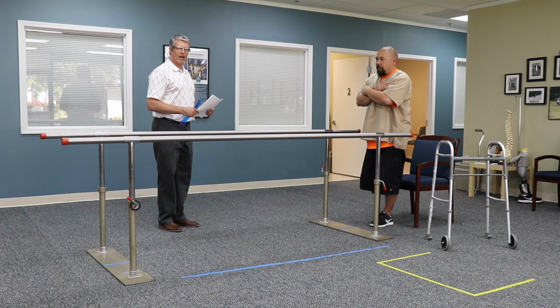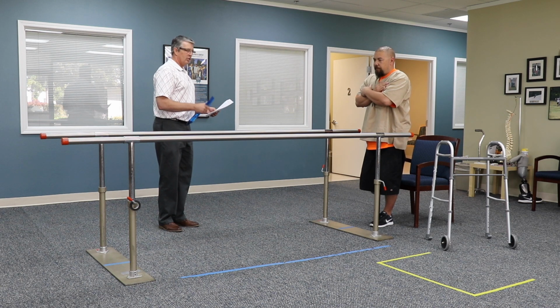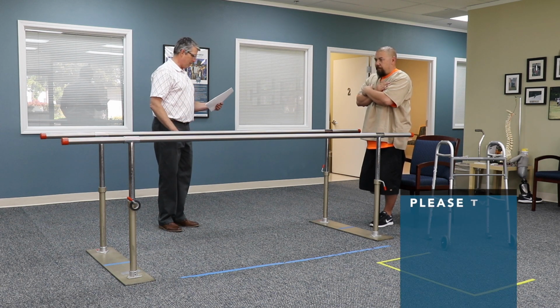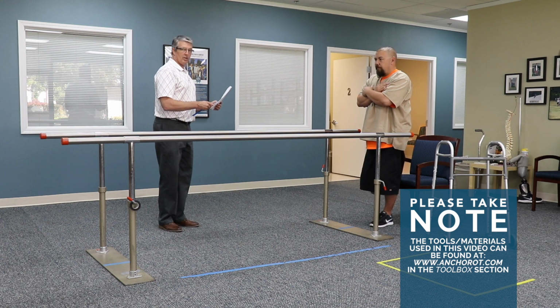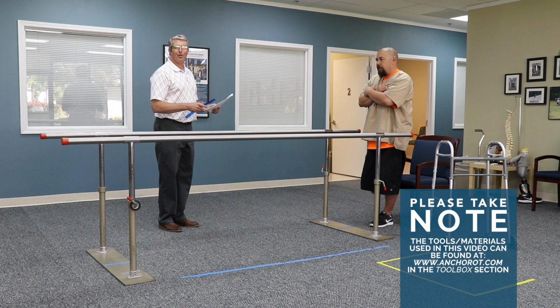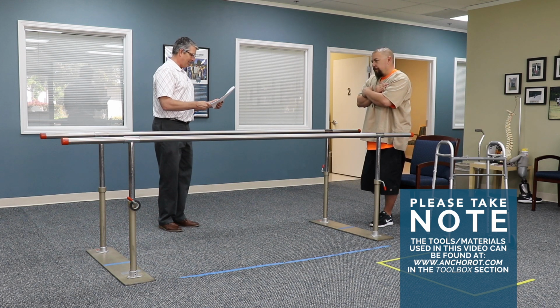Very stable, even without his prosthesis. Took 1 attempt to rise from the chair. That's number 5, so that's a 2. Number 4, rising from the chair, is a 2. The immediate standing balance is a 2. And he's going to be able to stand there for 30 seconds. That's going to be a 2.